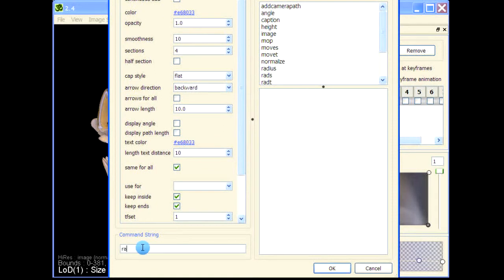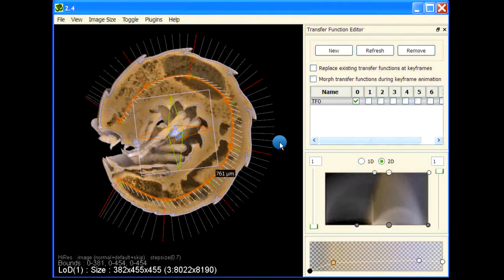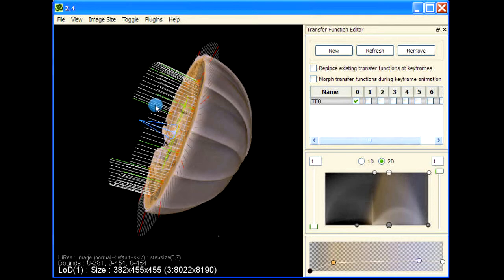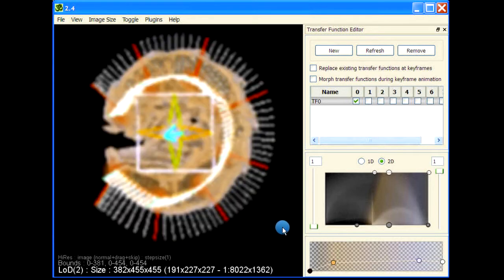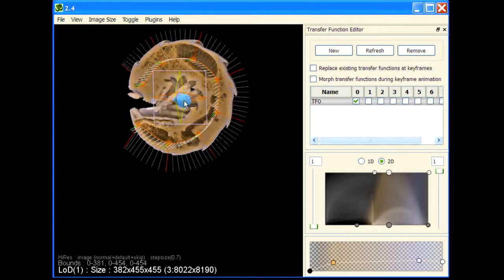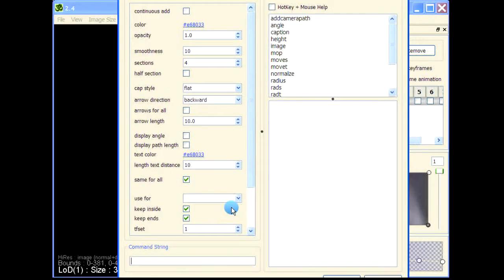We add another point here, move it up, and add smoothness to the path. This is our path. Let's give it a radius, say 100.